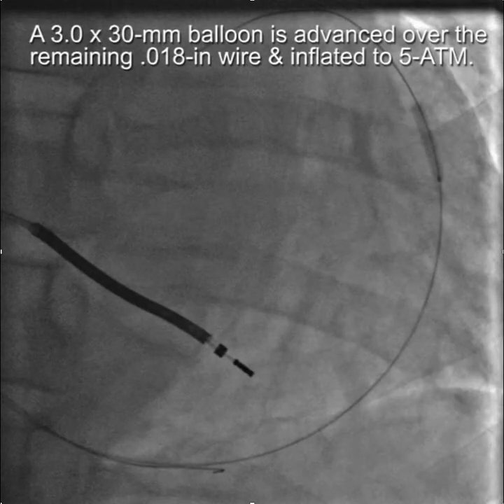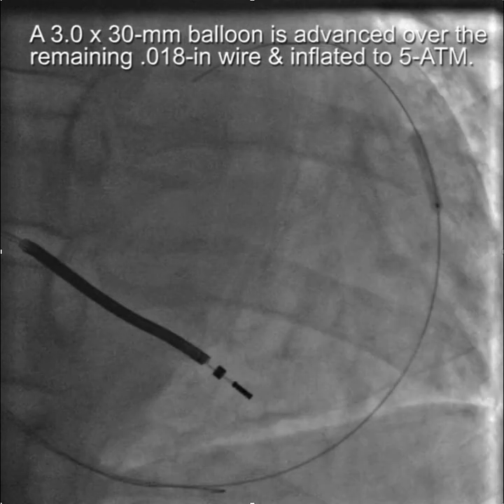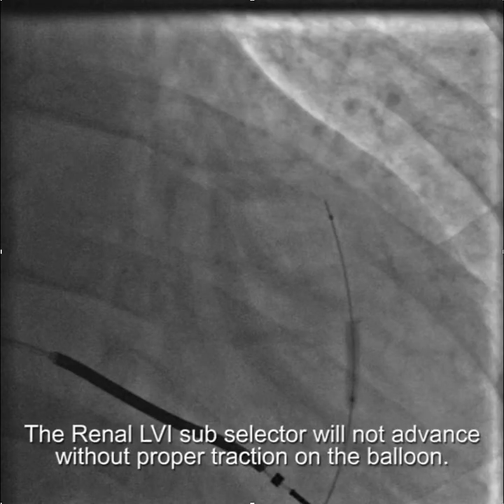So the final option is to advance a balloon over the remaining wire and inflate the balloon and use it as an anchor. So here we use a 3 millimeter by 30 millimeter balloon, advanced over the remaining .018 wire and inflated just to 5 atmospheres. And how high we inflate it is sort of a dealer's choice. It's never really quite clear.